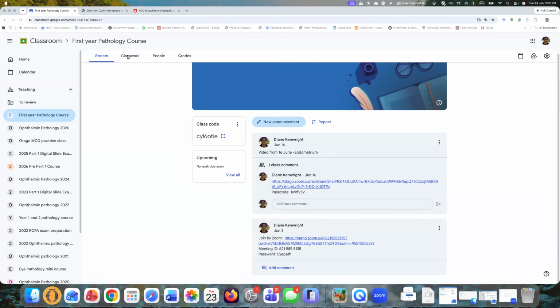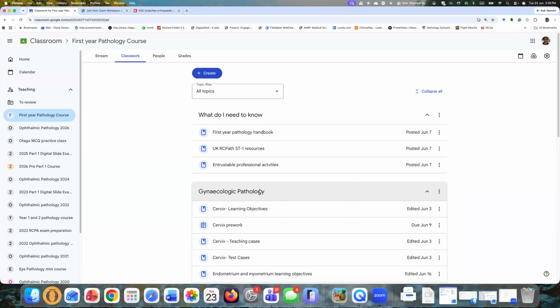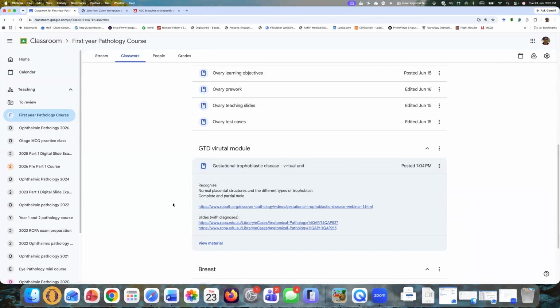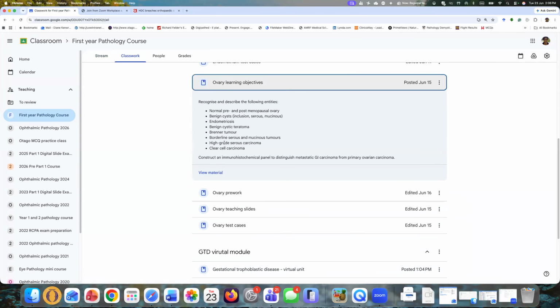Great. So in our classwork this week, here we go. We're just finishing gynae pathology here. So we'll open gynae pathology and we're doing ovary. And I'm away next week at a conference, so I have put together the GTD virtual module to do during the week that I am not here. But let's have a think about these. So ovary, these are the key things that you need to learn.